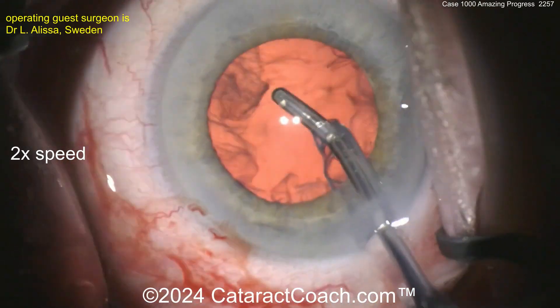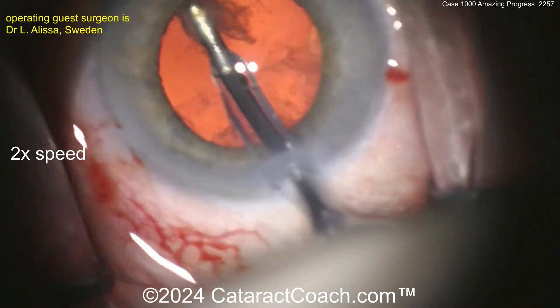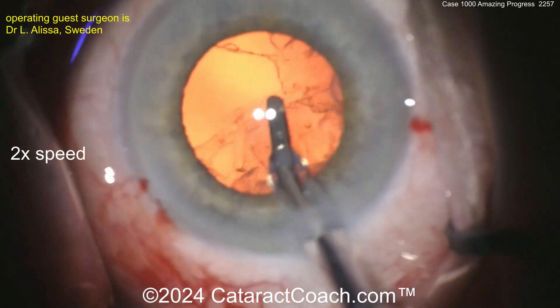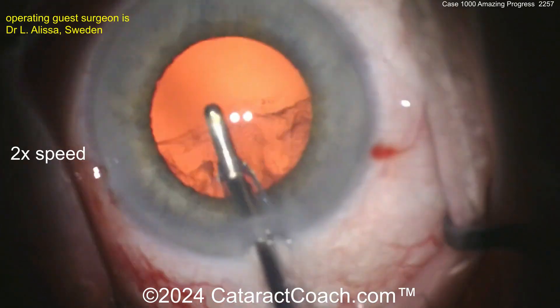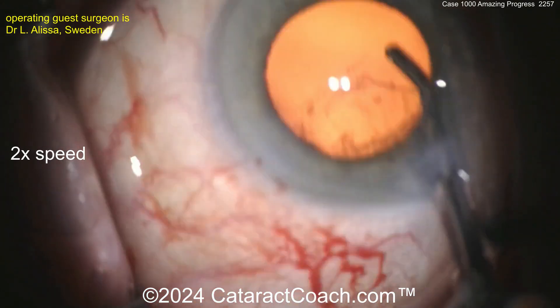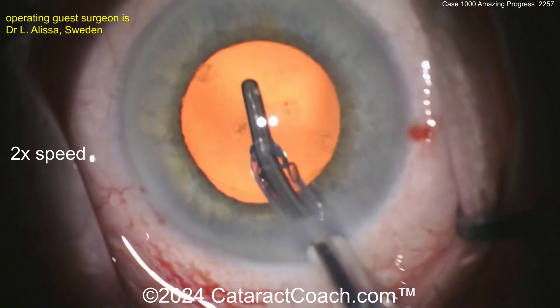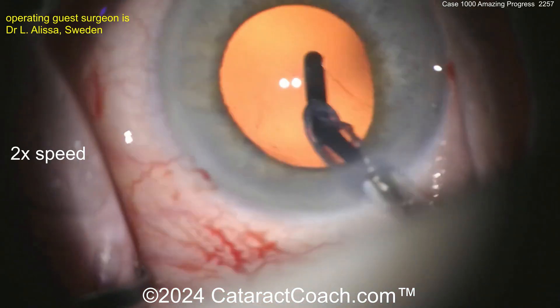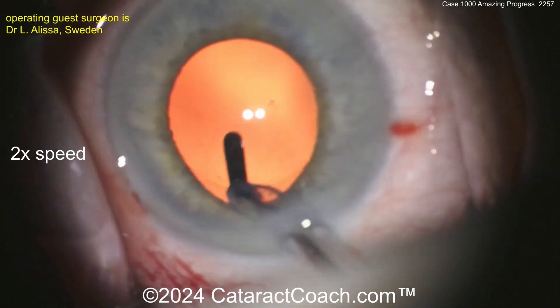Cortex removal is going to be pretty efficient here. We'll get the lens in and call this a day — routine case, but the surgeon has made great progress. Removing the lens cortex — now the pupil may expand a little bit from higher infusion pressure from the IA probe. Maybe a little bit of capsule polish in there. I don't want to leave any smudgy lens material on the posterior capsule if I can help it.